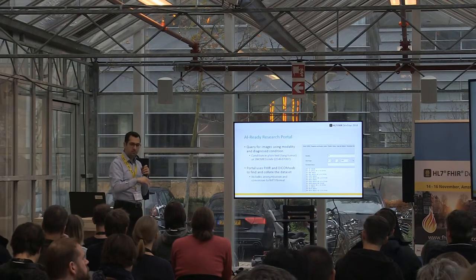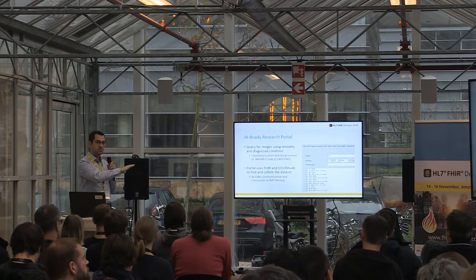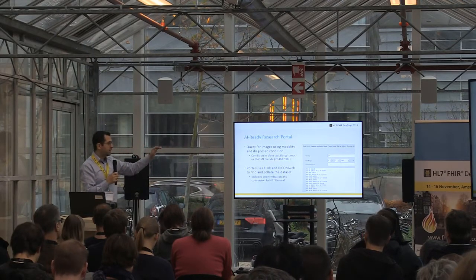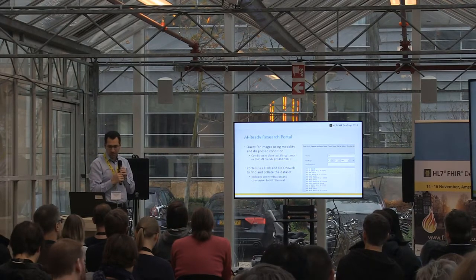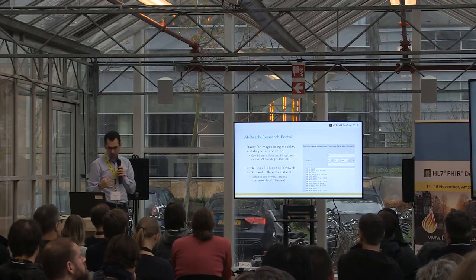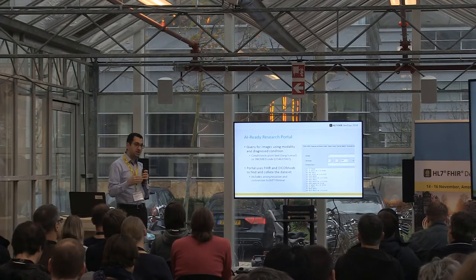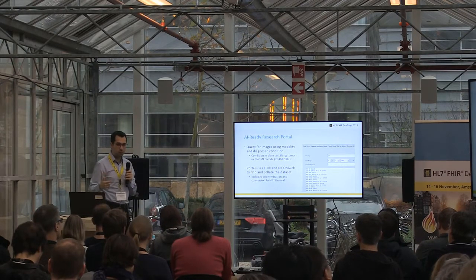You put this VM in, and you're able to query using all kinds of different parameters. The one example I'm showing you here in the screenshot is a modality along with a study date range and things like that. You're also able to search using procedure, SNOMED codes, et cetera. It will use FHIR and DICOM Web to get you information that is then sorted for you, so whatever matches your criteria, and then you could use that for your research. It will also anonymize the studies for you, and it will convert the images into NIfTI format, which is pretty good for machine intelligence processing.